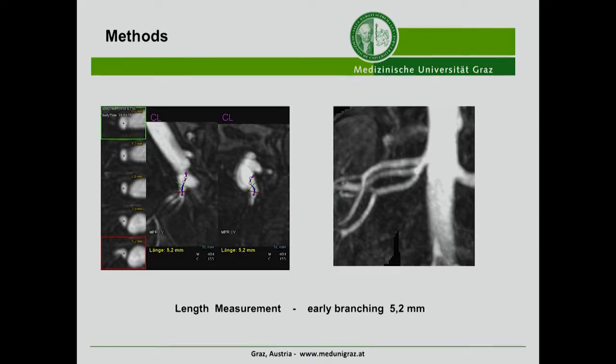We did length measurements, especially this is helpful for the surgeon in these patients where we detected early branching. In this patient, early branching was detected after 5.2 millimeters.